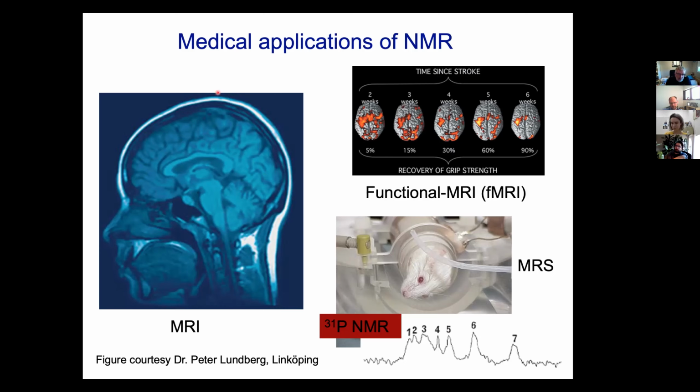That's pretty hard. So you really don't see much definition there. But look at the fantastic definition you can actually get inside the brain, which is a tissue that's very high in water content. And you can see even the spine here. You can clearly see what's going on with it. So MRI has made its place in the world and will remain there for a long, long time.